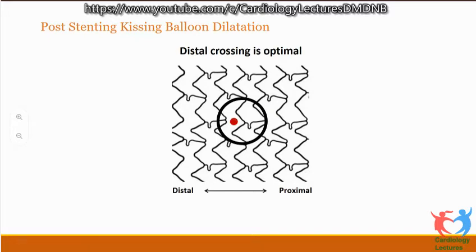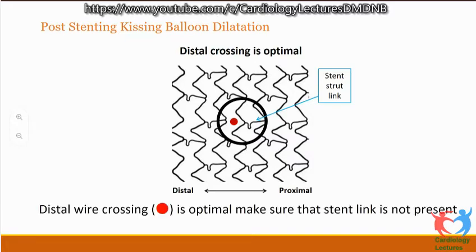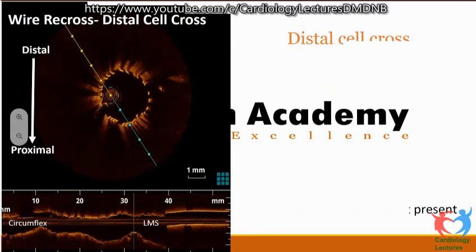So number one, we know that when you are doing a provisional stenting, go through the distal strut, and also we need to check that the wire should go through a strut which does not have a connector. Otherwise, when you cross with the connector, you will leave the connector behind. You will not be able to compress. So this was the strut which was taken because there's absolutely no link. The red dot shows there was no link. So this was the optimal site for the recross.